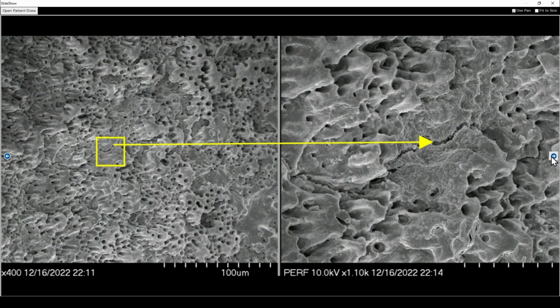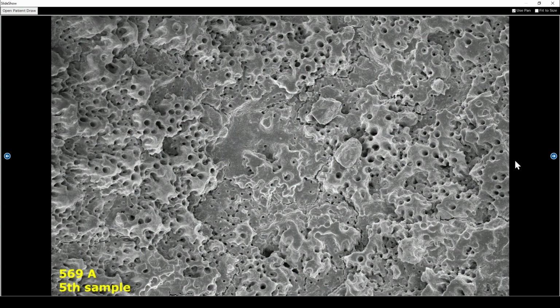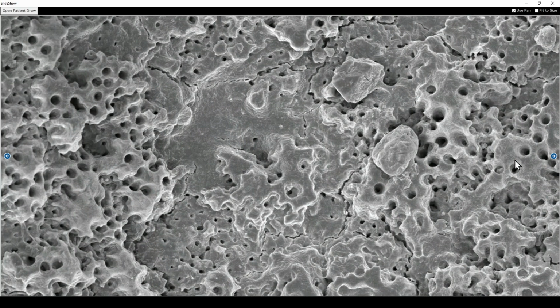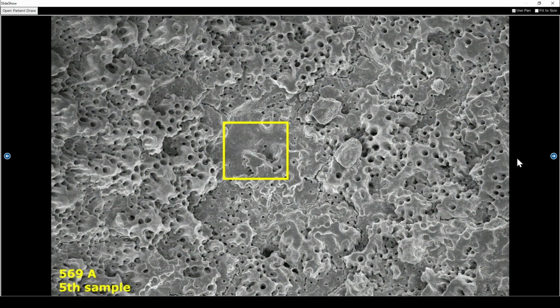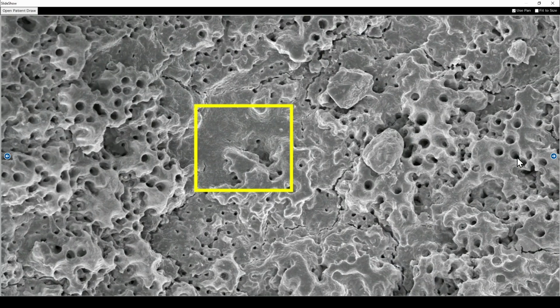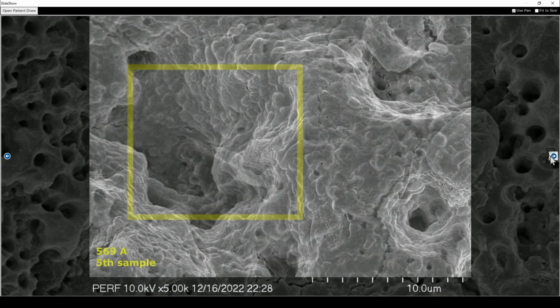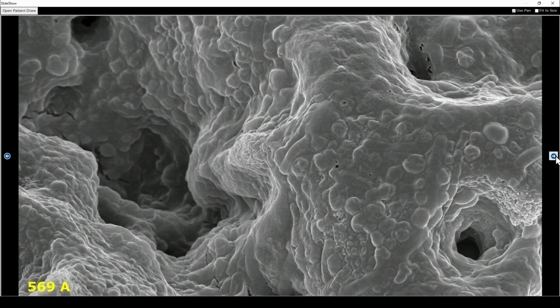So when you look at these, start to refine your pattern recognition, and after a while, you'll see the signature almost immediately. Even at low power, you can start to identify likely spots where a biofilm is present. These are not like pictures in the JOE where everything is obvious. You have to do a little work and actually look very, very carefully. They're not planktonic bacteria. They're embedded in this EPS, and you have to be careful as you look at these.